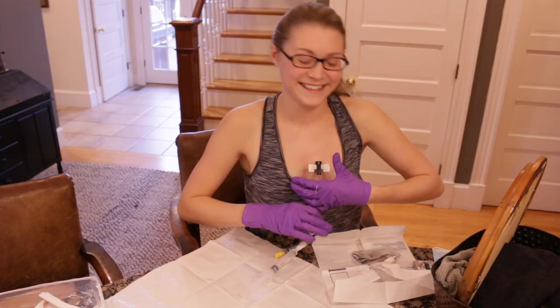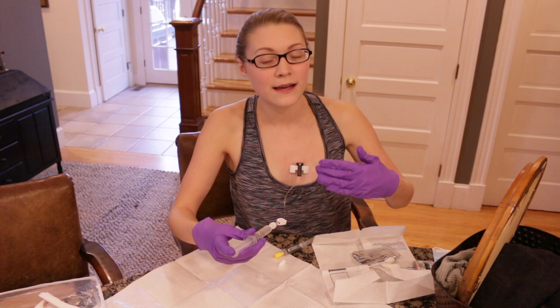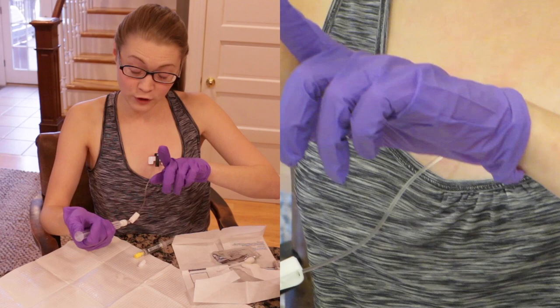All right, oh my goodness — I have not done that in so long. So here's how I do it: I flush in a little bit and then I pull out to make sure I get blood return, which will tell me I'm in the right place in the port. It felt good when I pushed it in — I could feel the back of the port. That's what you want. I'm flushing, it's flushing. There's going to be blood in the tube, so if you don't like that, don't look. Blood return — woohoo!